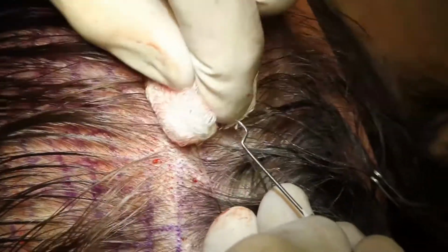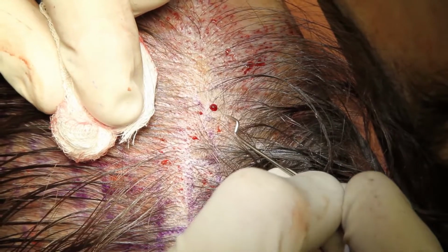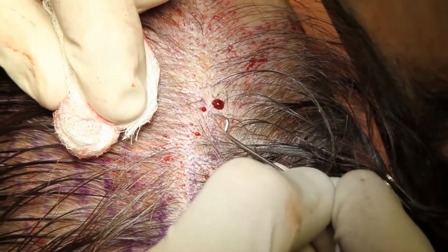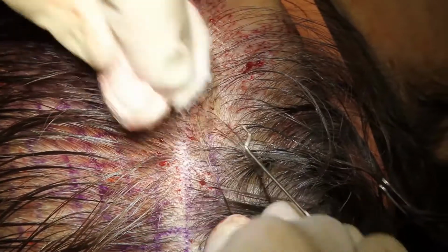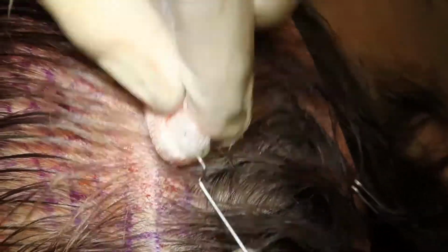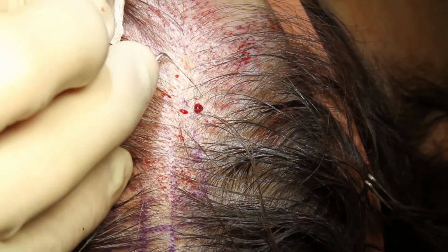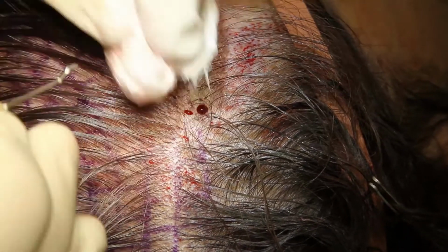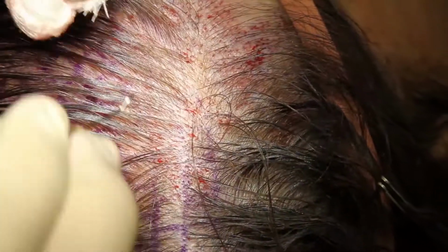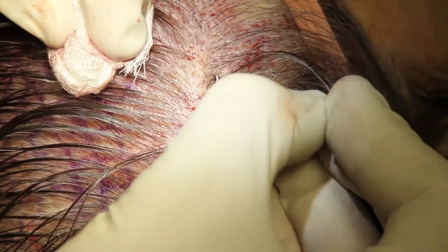I've injected this with a very nice combination of local anesthesia with a little adrenaline in it, which helps to make sure that you just get tiny pinpoint areas that bleed. You really just don't have any bleeding on these things at all. And while I'm talking here, I'm also counting, so I'm working very diligently on making sure that the hair density right along his part is perfect. I want to make sure he's got excellent hair density along his part.